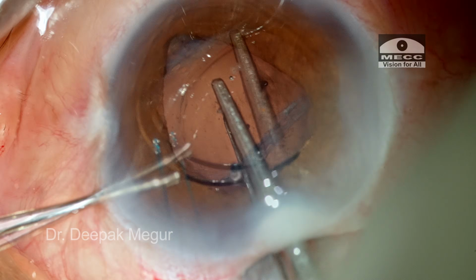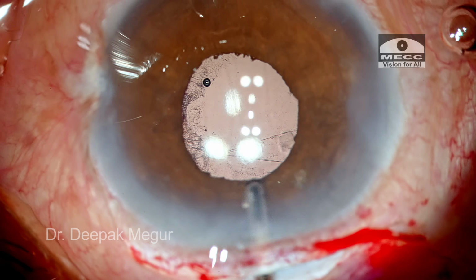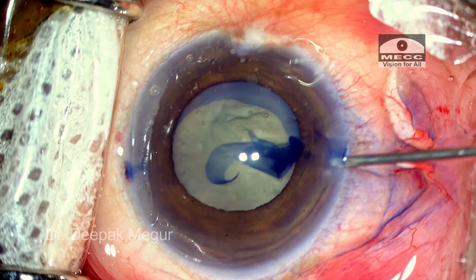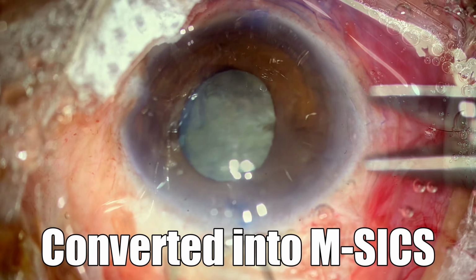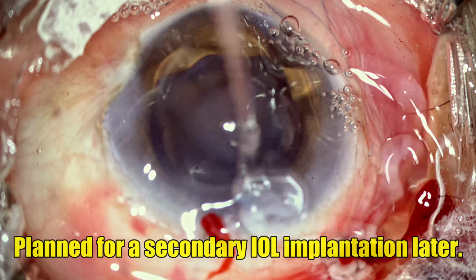Hi, let me share with you a case of a secondary IOL implantation in an eye which underwent an eventful surgery about 10 days back. This case was operated 10 days back by a young surgeon, and he encountered a PC tear during phacoemulsification. So he abandoned phaco, converted to SICS, and planned for a secondary implant later.